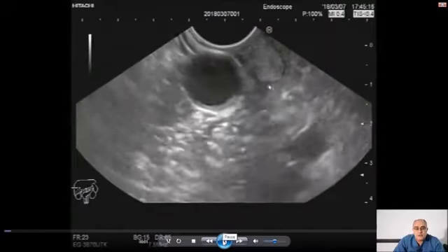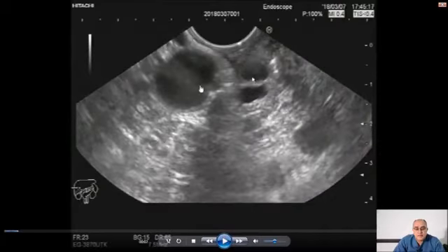Now the echo endoscope is kissing the papilla in the mid second part of the duodenum, and here this is the abdominal aorta appearing as a circle in cross section, and here this is the stack sign. This is the region of the papilla, and this is the common bile duct, the channel nearest to the echo endoscope, and this other channel is the pancreatic duct.